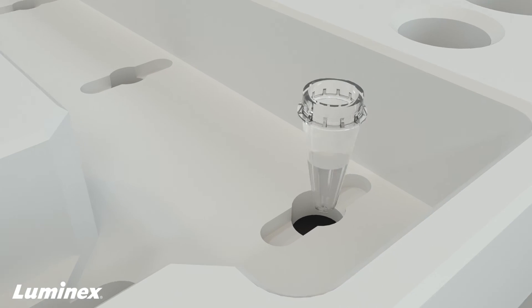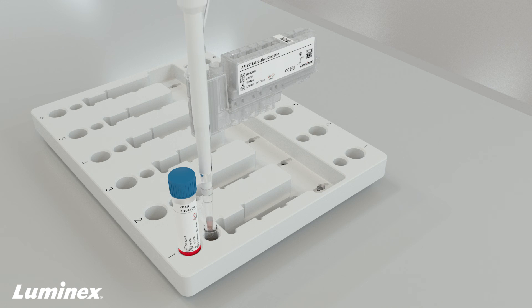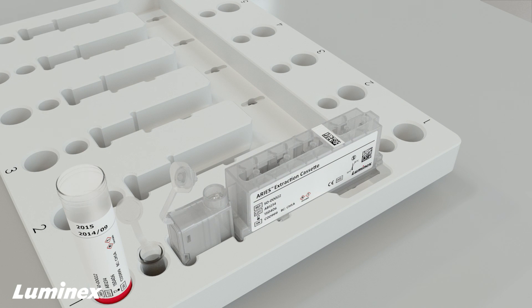When running an LDT, just pipette the PCR reagents into the PCR tube, snap on the extraction cassette, add the sample, and close the cap.